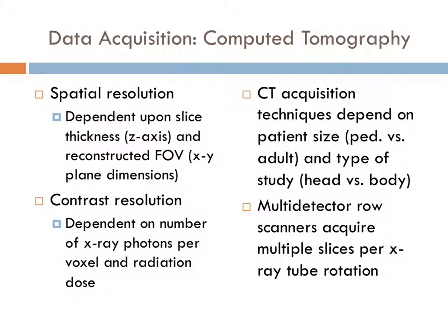In relation to PACS, study splitting in CT is important for assigning specific accession numbers associated with each type of exam. So, for example, a doctor may order a chest, abdomen, pelvis exam all in one. Well, for PACS purposes, the chest needs to be separated from the abdomen and pelvis, and each of them needs to have separate accession numbers.